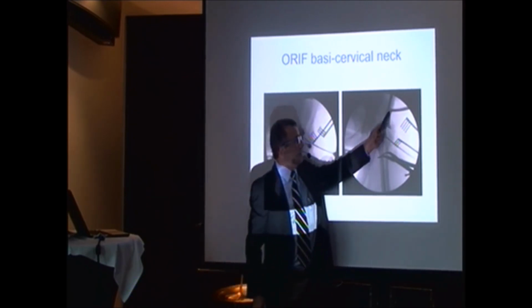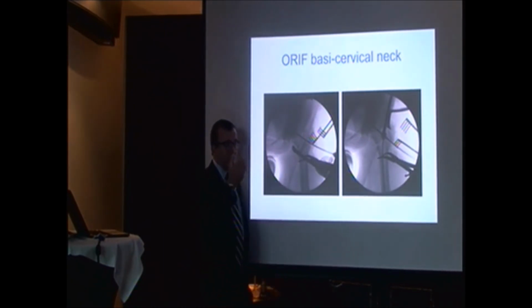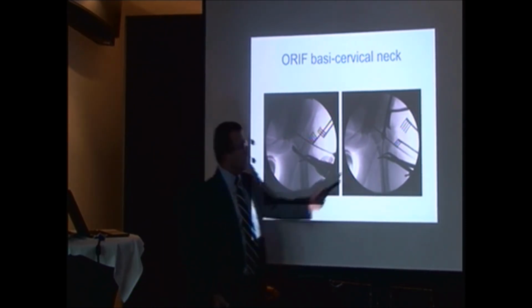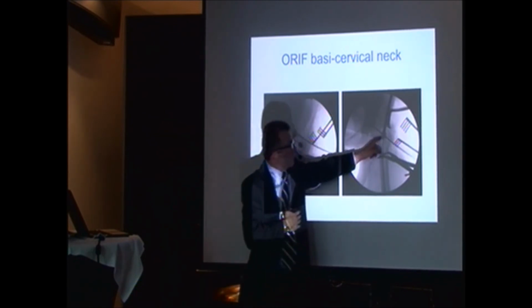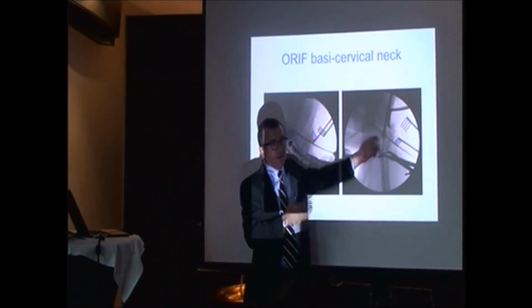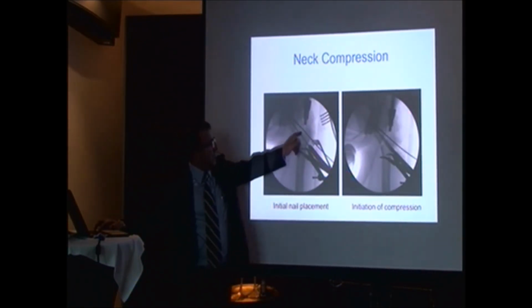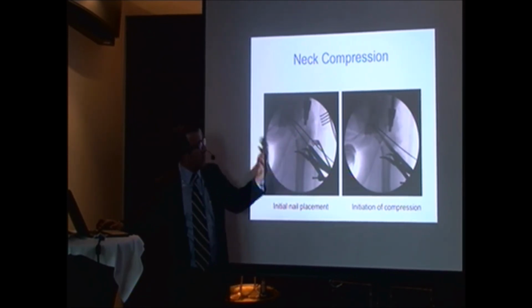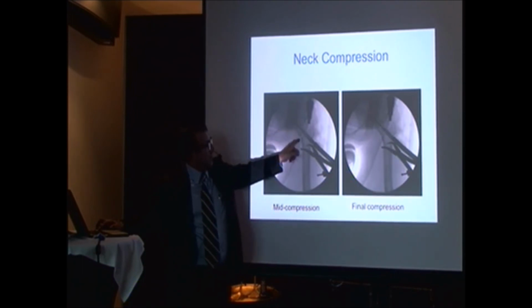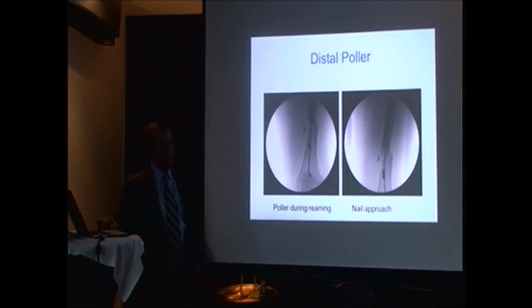So the technique we did is we have to get a concave retractor. We use, we call it a Richardson or a Meyerding, and the concavity of the retractor catches the reamer shaft as it's spinning and pushes it medially, so you create a path for the nail to allow the fracture to reduce. And once the nail comes in, it still causes a little bit of separation, but you can see now we release the traction and we do compression, a little bit of compression, and over here full compression, and we reduce the fracture nicely. Then we have another problem.